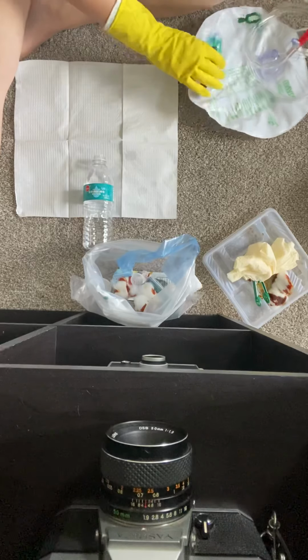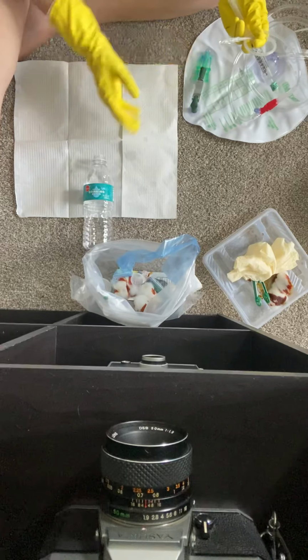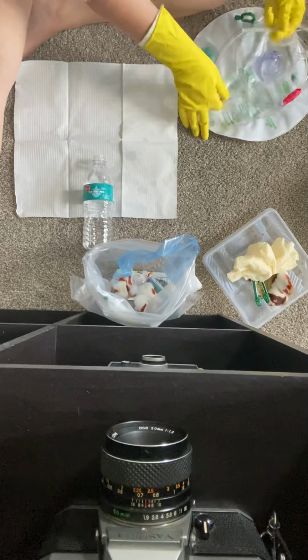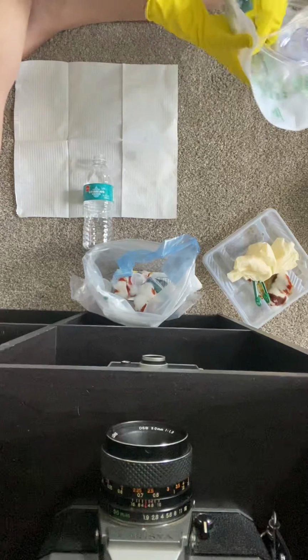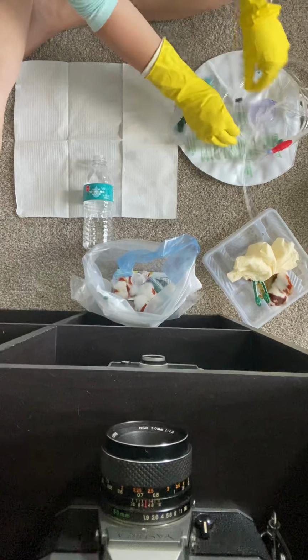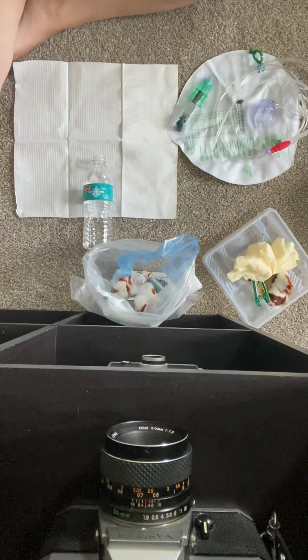And then usually I would empty my bag. If there was urine in the bag, I would empty it before throwing it away. You wouldn't just want to throw the bag away with the urine. But then I would take this whole thing, so my bag's empty, and put it in the trash. So then I'd obviously take my gloves off, and then do my hand hygiene.